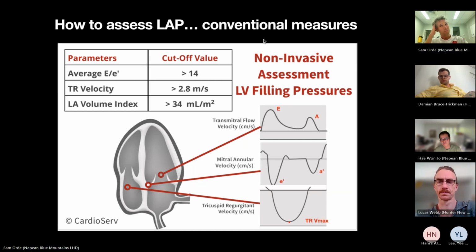Yeah, Damien. Hi, John. I guess the reason that patient might have got fluids is there was concern about preload dependency with severe AS and vasodilatation, in the context of sepsis. Obviously what you've shown is that giving fluids resulted in harm. How would you use echo in that patient to determine preload adequacy in the context of severe AS? Yeah, great question.